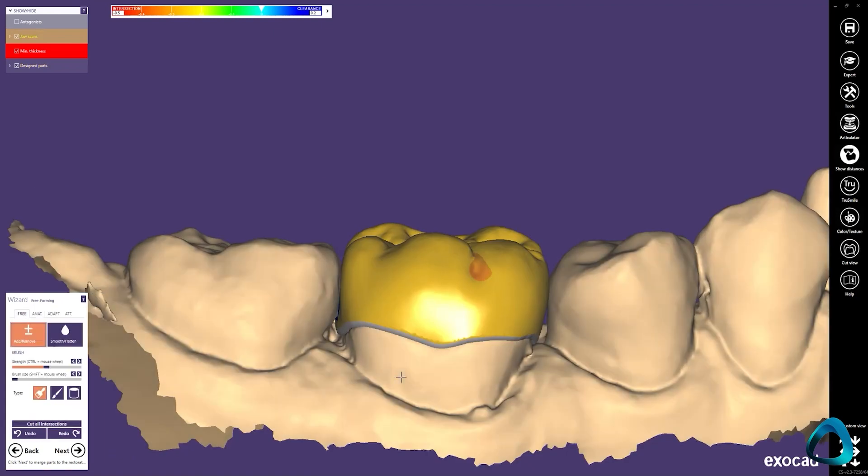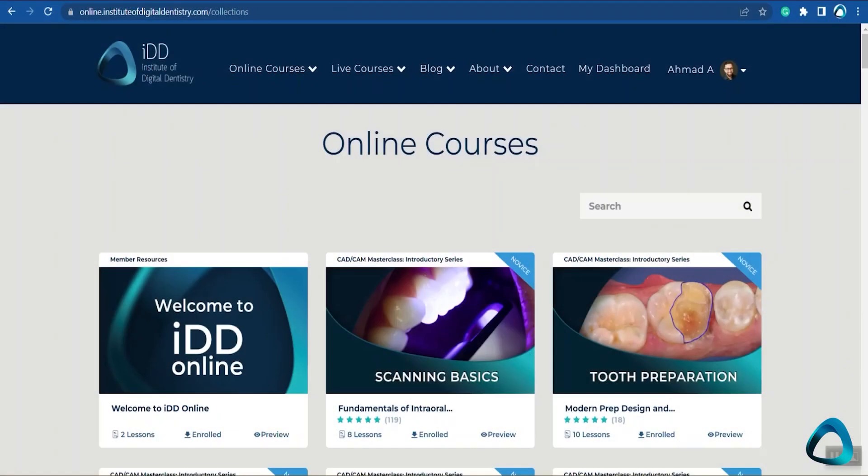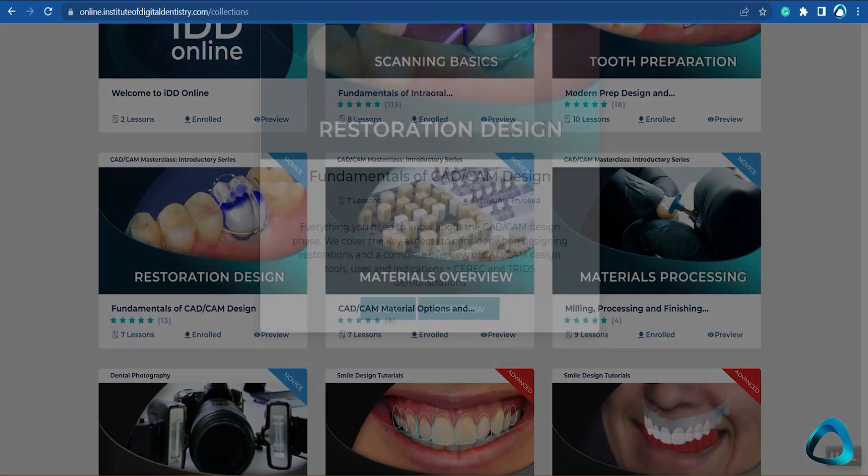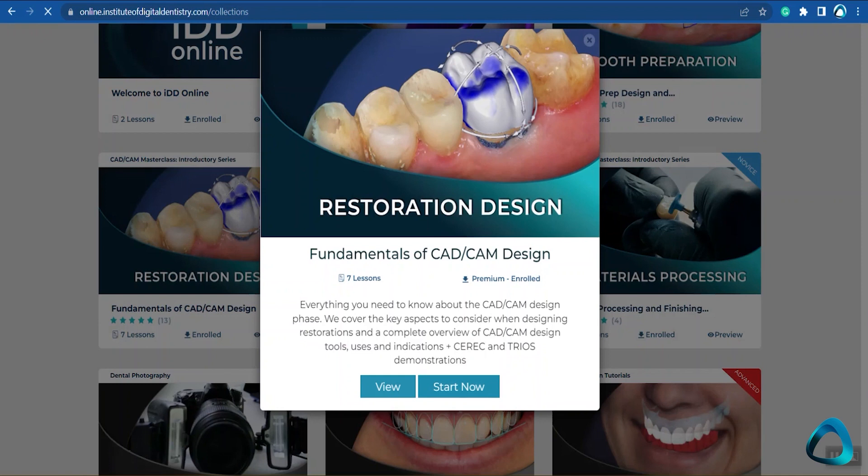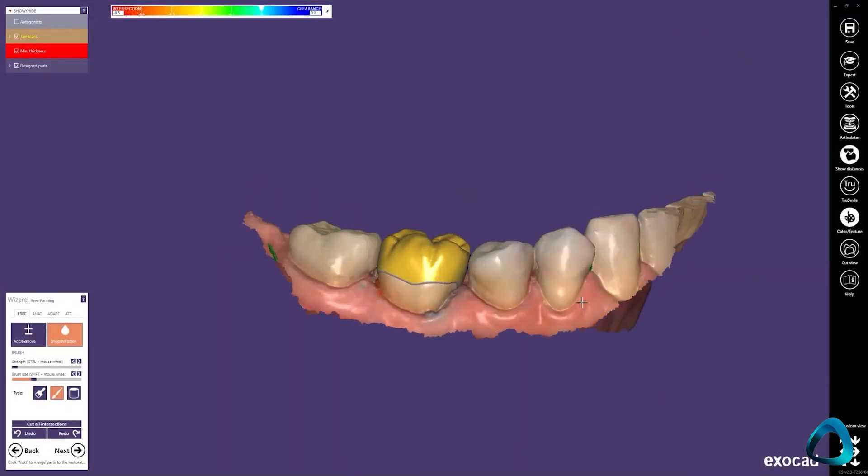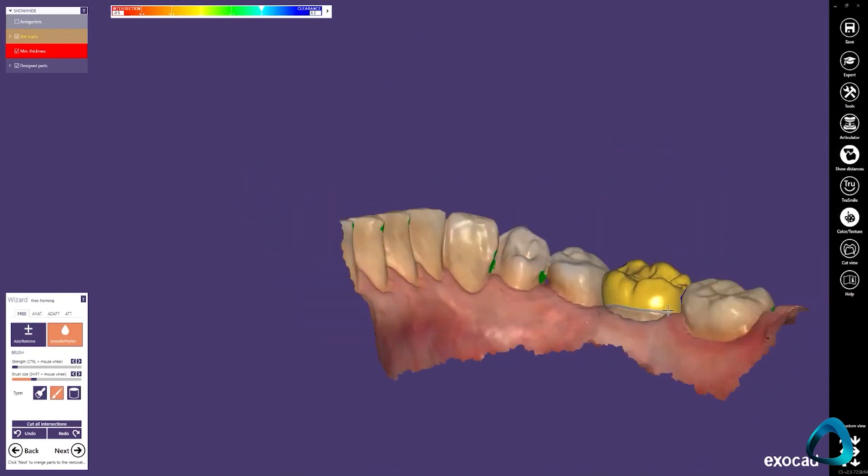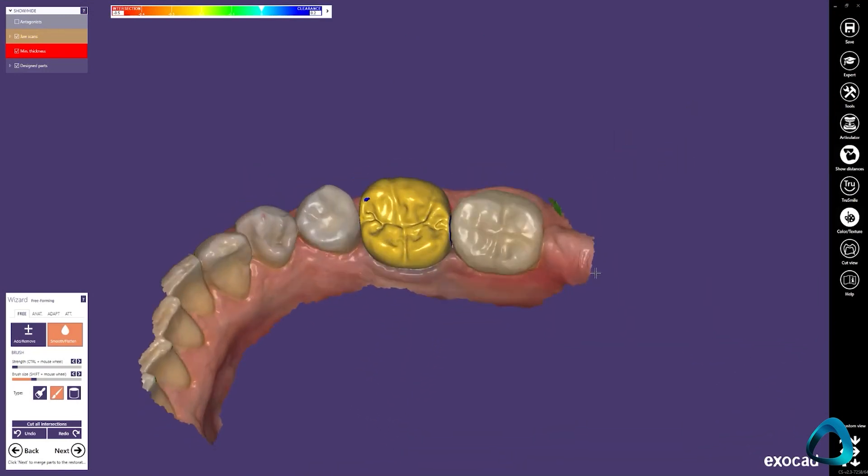Finally, it's vital to check the minimum thickness and ensure that you have not breached the desired material's minimum thickness, as this will compromise longevity. If you want some detailed training on CAD designing, we have our fundamentals of CAD CAM design course available in our IDD online membership. Once you are happy with the design, check your final restoration from all directions before proceeding in the workflow.